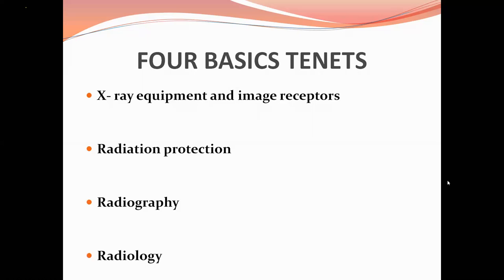Now, you may think that the last two are interchangeable, but they are not. Radiography is basically the production of X-ray images. In Pakistan, usually this is done by technicians who are operating those machines. We call them radiology technicians over here, but maybe the more correct term would be a radiographer. And radiology basically is the interpretation of those images for the purpose of medical diagnosis. So that is the difference between radiography and radiology.